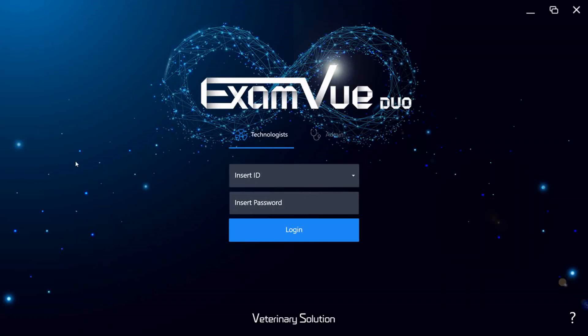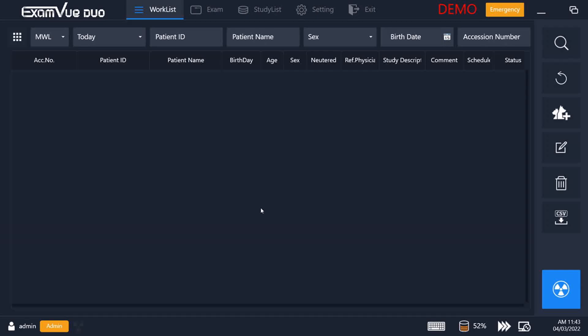When you first start the software you will see the login screen, where you will log in as a technologist or an admin. You can have as many technologists registered at your acquisition as you want, and it will track who is taking what X-rays and what rejections, deletions, and sends for future analysis. You can also log in as an admin to have access to changing the settings and other options in the software.